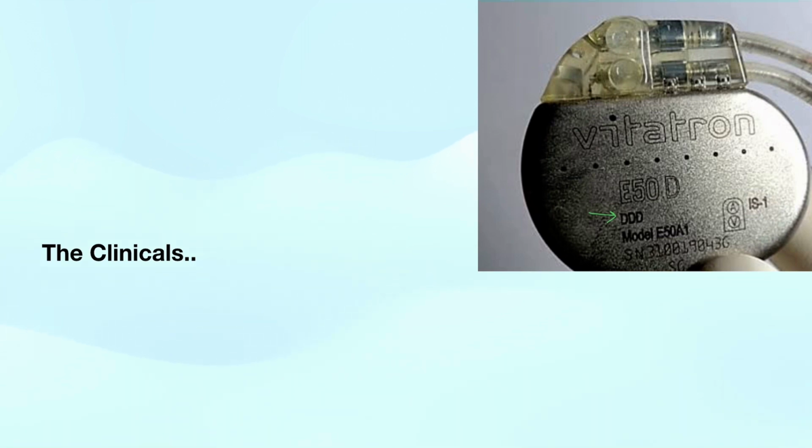It is basically a three-letter coding system written on a permanent pacemaker. A four-letter coding system is also there, and a five-letter coding system is also there. But most commonly we use the three-letter coding system.